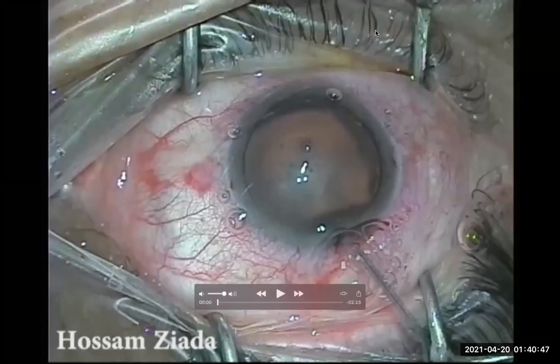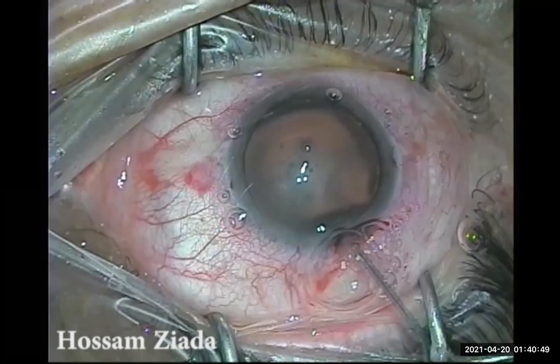Bismillah ar-Rahman ar-Rahim. Hello everybody, welcome again to the Adai Academy. Today we'll show you one of the difficult cases which you may face in your life, which is the intumescent cataract or the phacomorphic glaucoma.